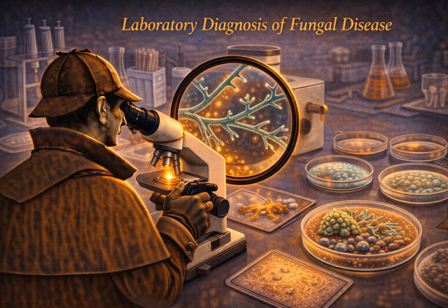If you suspect Mucor, you have to write it clearly on the lab requisition form. Rule out Mucor. That specific note tells the lab tech, step away from the grinder. Instead, they will carefully mince the tissue, chop it into small pieces with a scalpel to preserve those fragile non-septate hyphae. That is a massive life-saving distinction. Mince, don't grind. Mince, don't grind. It shows up on exams, but more importantly, it saves lives.